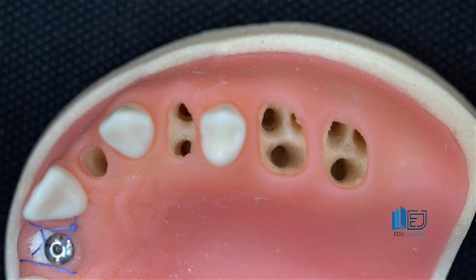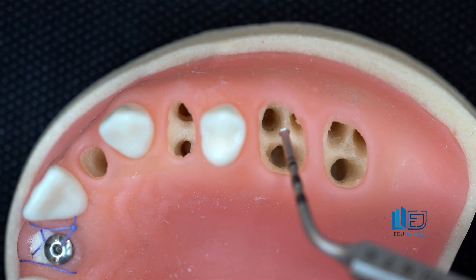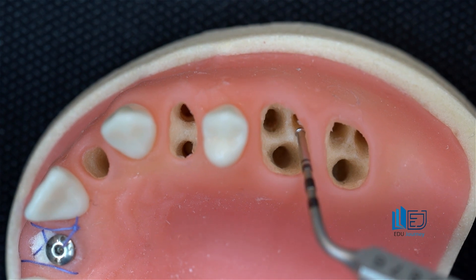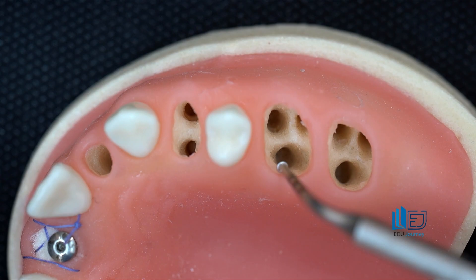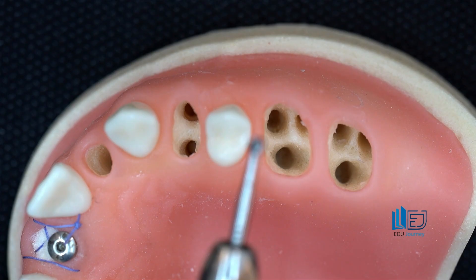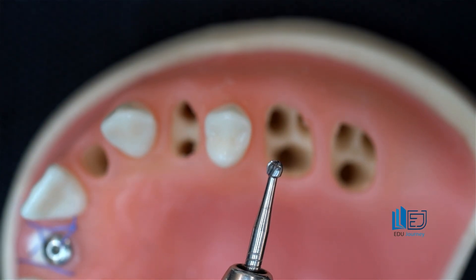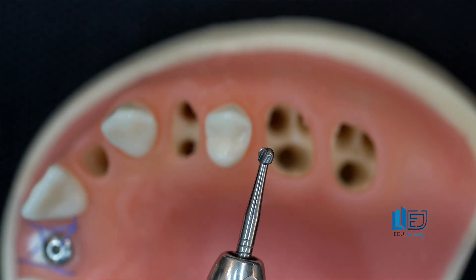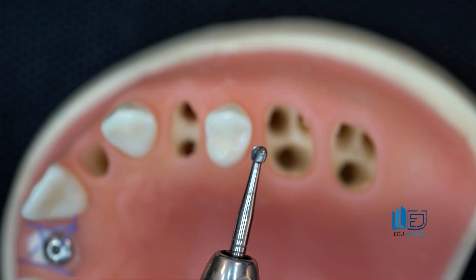To prevent the drill from slipping off the furcation and veering toward one of the three sockets in the upper teeth, or the two sockets mesially and distally in lower molars, I can use a straight handpiece and a round drill to carefully turn the distinctly sharp anatomical tip of the furcation bone into a smooth, flat surface. This way, your drill won't slip.